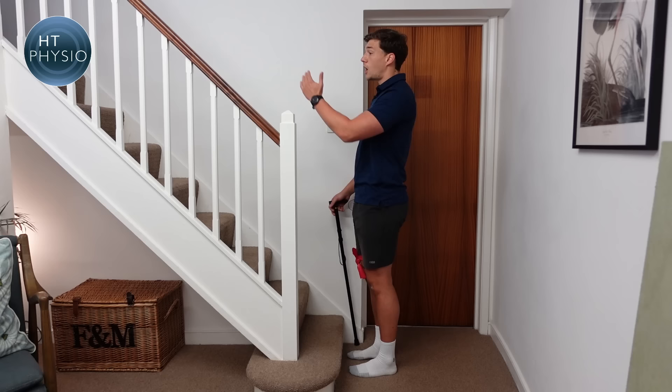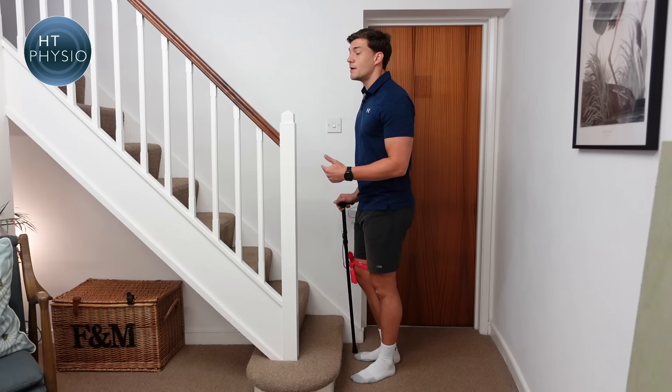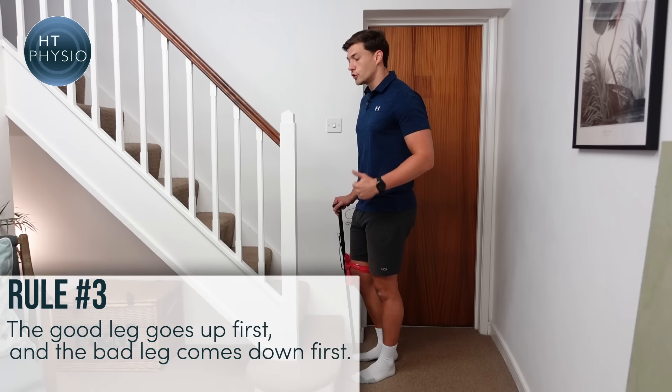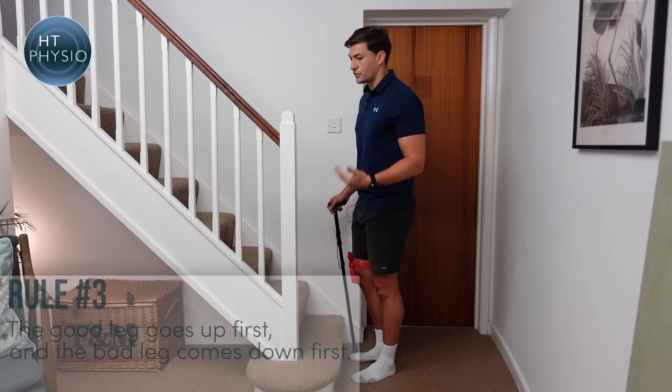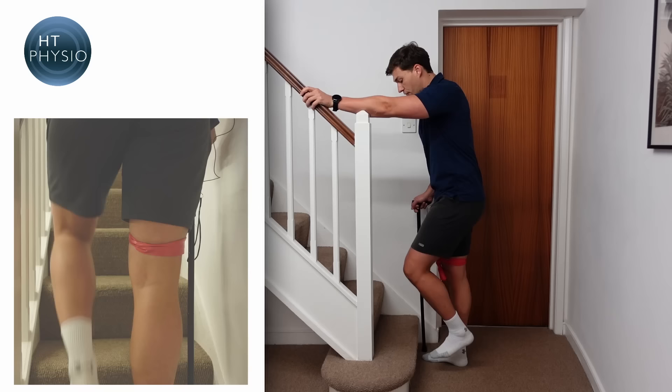To climb up the stairs: handrail on the left means left hand on the rail, and the stick in the opposite hand. In university I was taught a saying to help remember which foot goes first — 'the good go to heaven and the bad go to hell' — meaning the good leg goes up first and the bad leg comes down first. So we put our left hand on the rail, and keep the stick on the floor. The bad leg and the stick always stay together.